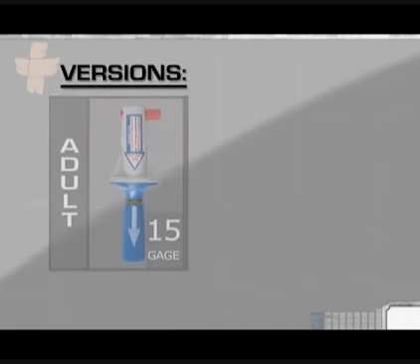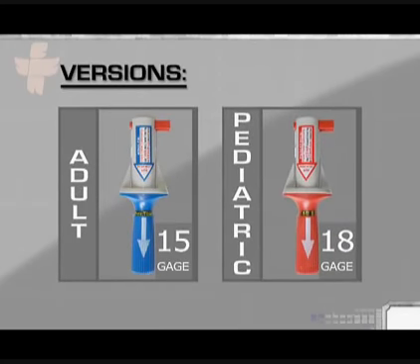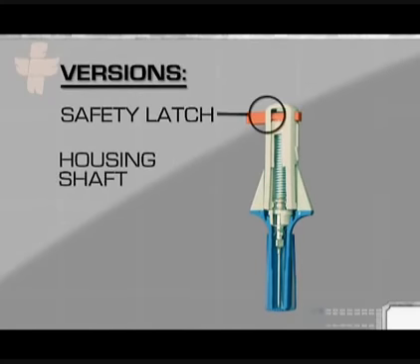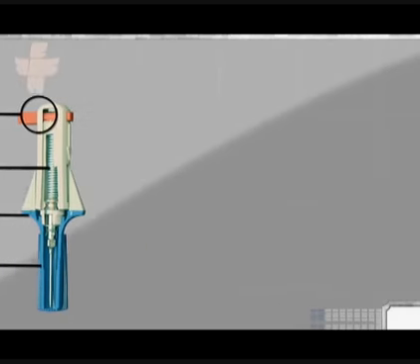There are 2 versions of the device, a blue adult unit with a 15-gauge needle and a red pediatric unit with an 18-gauge needle. Regardless of the needle's gauge, both devices have the same basic components: a red safety latch, a shaft that houses the spring, piston, and needle, a red or blue barrel with directional arrow for correct deployment, and safety wings to ensure proper handling.